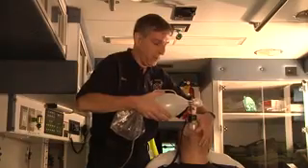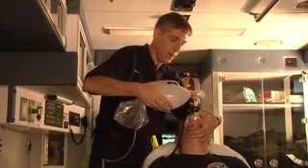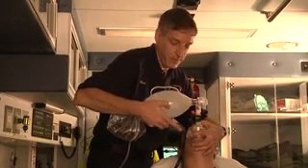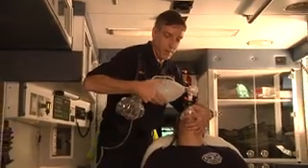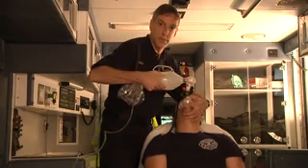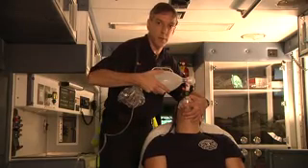Now, if we were going to assist the patient with ventilations, we're going to squeeze the bag to place air into the patient, and we could watch the patient's chest. In fact, that's the best feedback mechanism, to actually watch the patient's chest. When the patient goes to take a breath, you squeeze some extra air in to enhance the breath that the patient's taking. And if a patient was completely apneic, you could ventilate them at the rate that you see fit for that patient in order to maintain an exhaled carbon dioxide of somewhere between 35 and 45 millimeters.